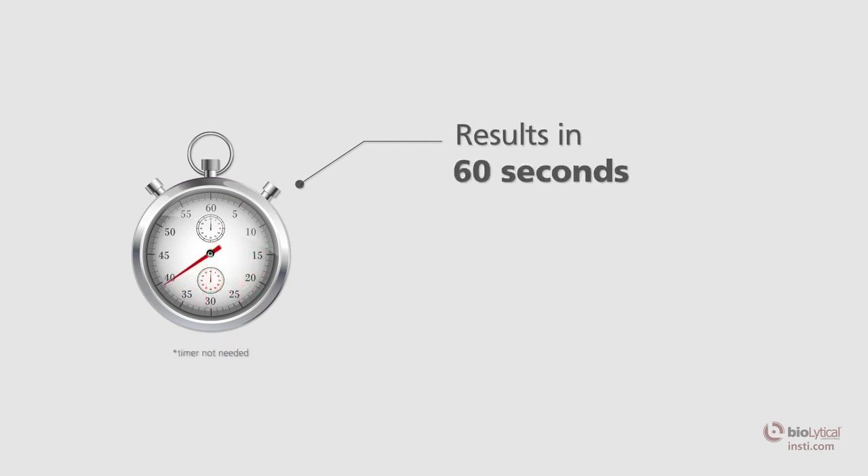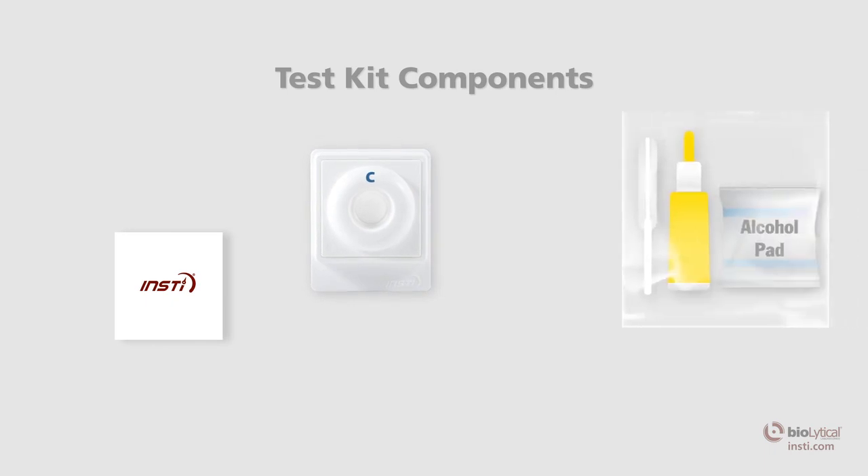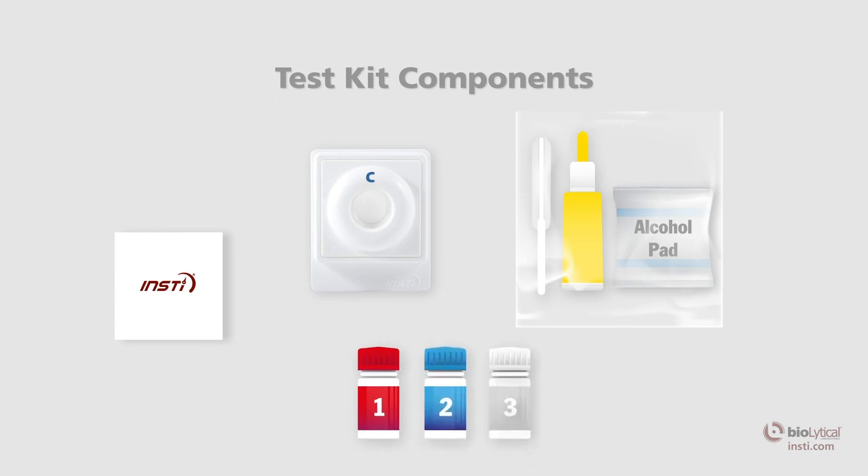The test procedure is simple and the test kit contains all the components required for testing: package insert, membrane unit, lancet, pipette, alcohol swab, sample diluent, color developer, and clarifying solution.